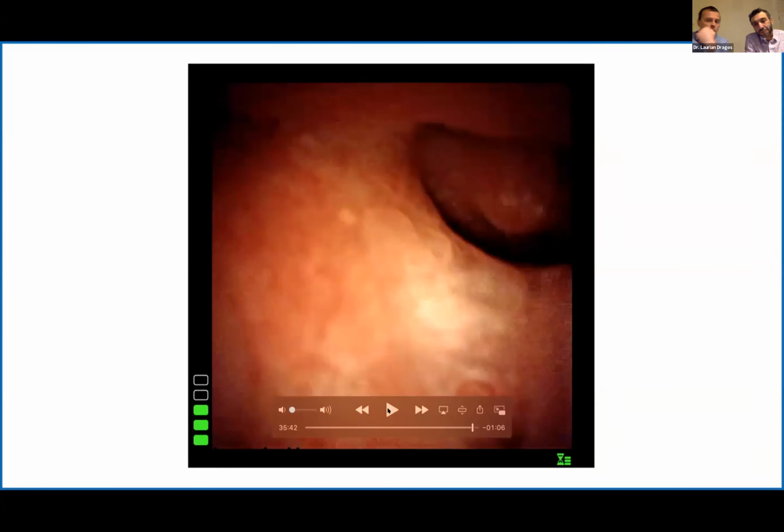But I think in this setting where you've got an open system, plus I'm providing a negative pressure in terms of sucking quite vigorously, the likelihood of us generating significant pressures would have been extremely low. When you're doing a flexible ureteroscopy, it's a completely different story. I can still guarantee you that if you're with the ureteroscope in the calyx and you put a lot of pressure, even if you have suction from the pelvis, there is still the risk of fornix rupture. So very, very careful with pressure.